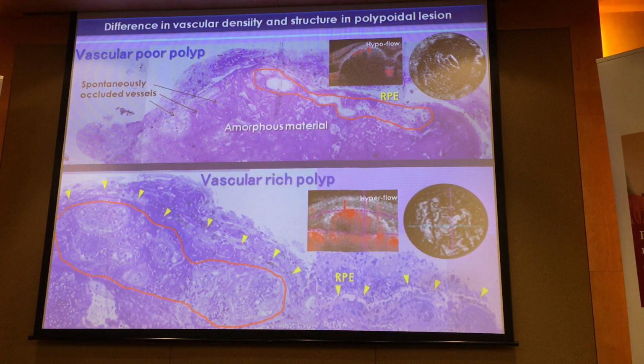The cases with no detection by OCTA were with massive subretinal hemorrhage and PED. If we have a serious PED, it is very difficult to detect the PCV vascular blood vessels. So 50% are such cases. This is a consecutive case series in my university.